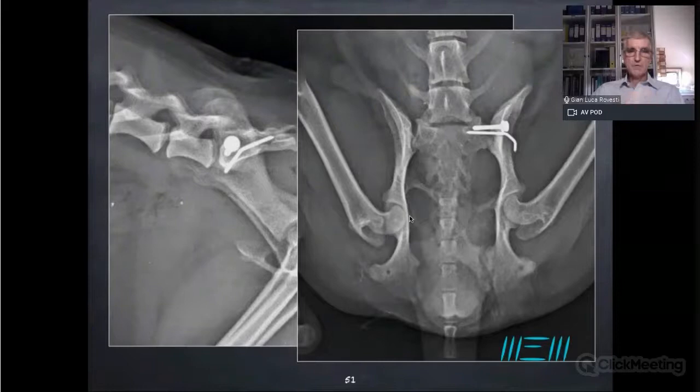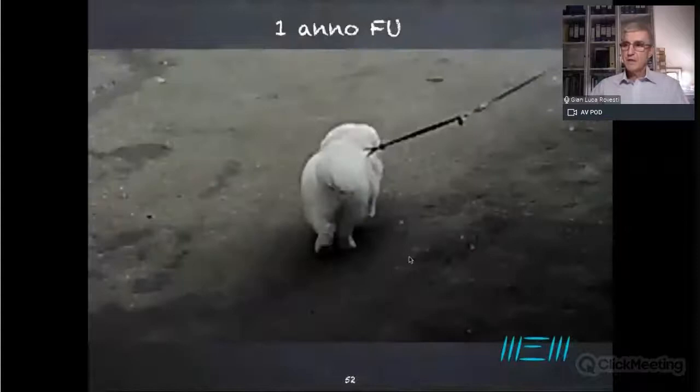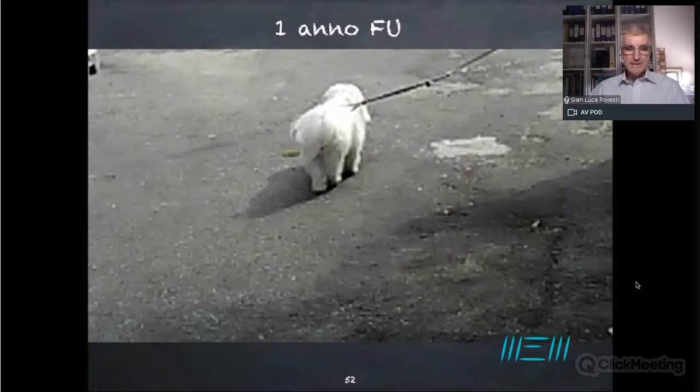And this is the follow-up after 1 year. Complete and full functional recovery. So with a quite simple technique, we could manage a potentially complex situation without performing any femoral head and neck osteotomy, which I don't like at all and I don't suggest at all.